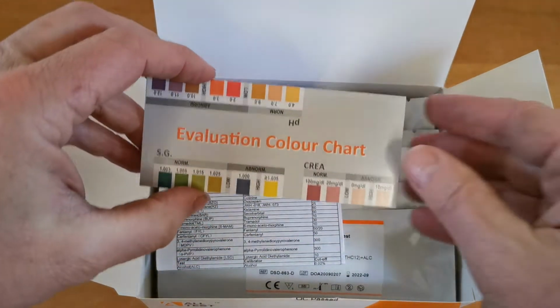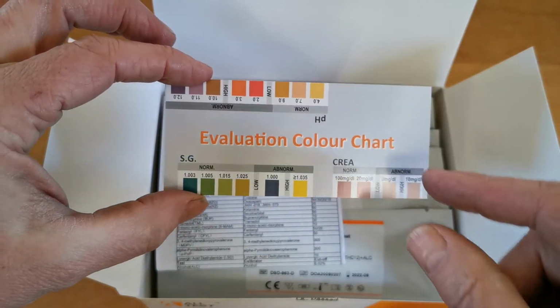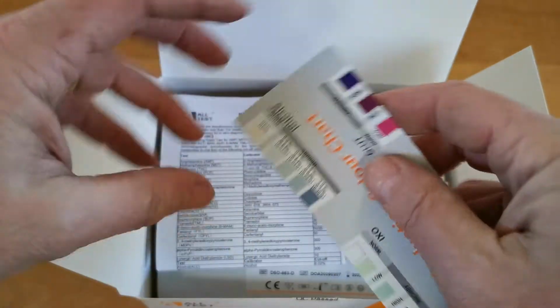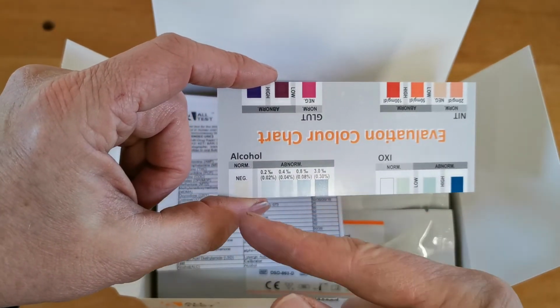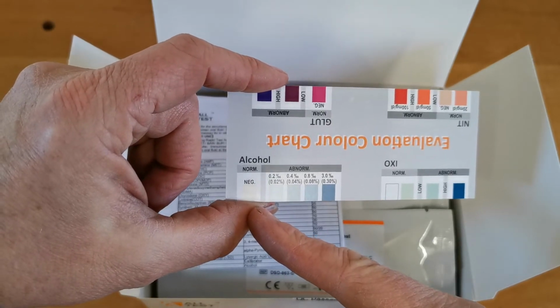The evaluation colour card for the alcohol. Now this is a universal card that's used for specific gravity, creatinine, pH on URS products, but also the important part in terms of the drug test is your alcohol identification and results indicators. It's a simple colour change that you're looking for in the window for a clear negative.